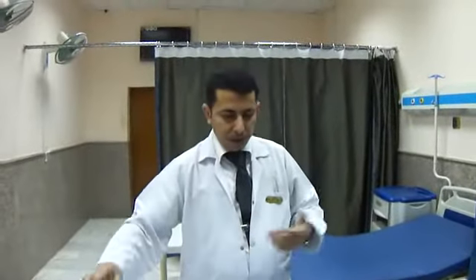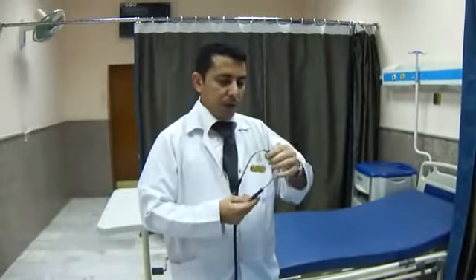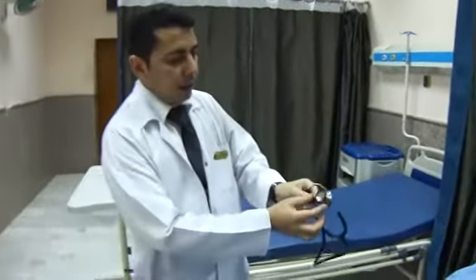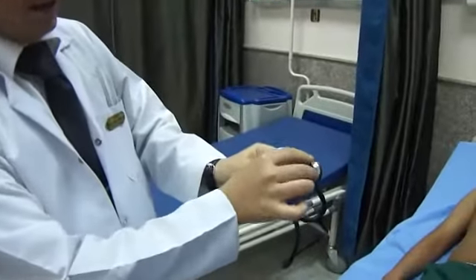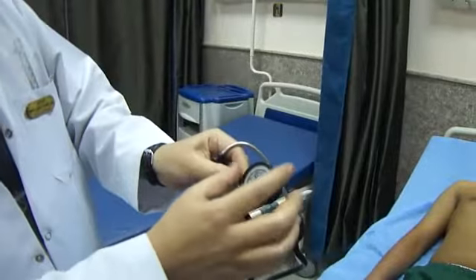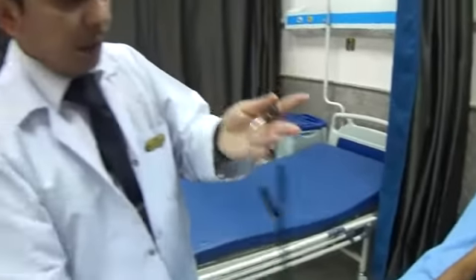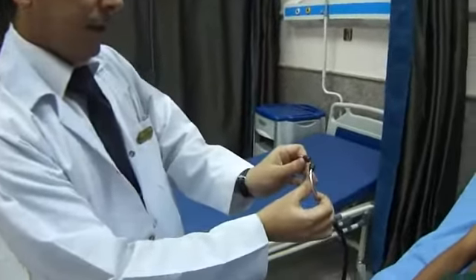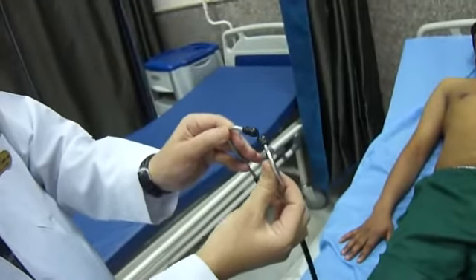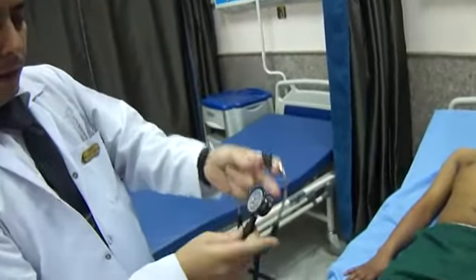Okay, the last step in the examination, as I said, for the precordium is the auscultation. We have to know that the components of any stethoscope consist of the bell, the small distal part, this is the bell, and this is the diaphragm, the larger part, and these are the ear pieces. The ear pieces should be directed anteriorly like this to fit properly with the external auditory meatus, and initially we have to listen through the diaphragm.